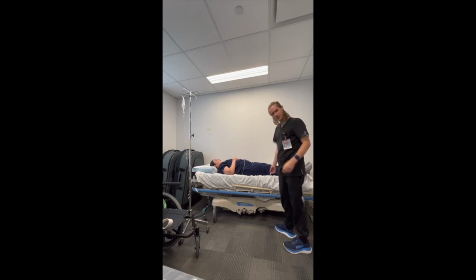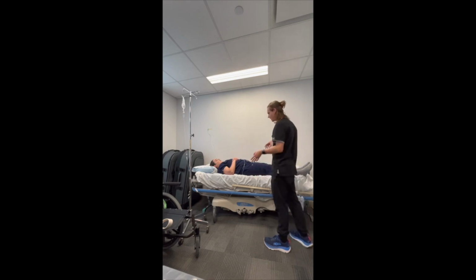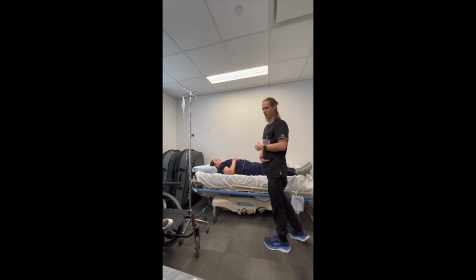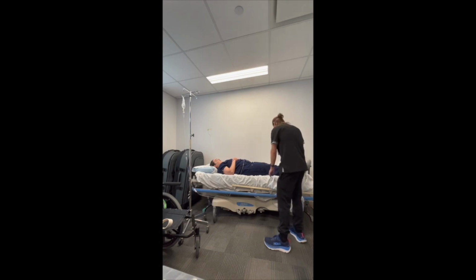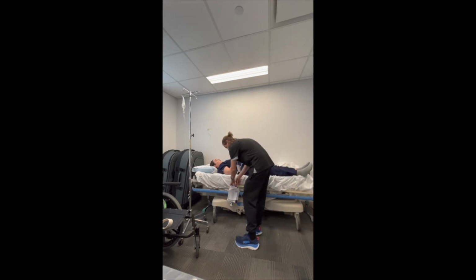So, upon our visualization, we're noticing two things. We have the Foley catheter here that is crossed under her leg and might cause us some issues. So we're going to try and get that out of the way and get this catheter in a location where it's not going to cross under or between her legs, basically, and cause any type of tripping hazard or anything that's going to snag, hold us up, or pull any lines out. So can you try and lift this leg up as much as you can? Good. And then we're going to move this right over here.